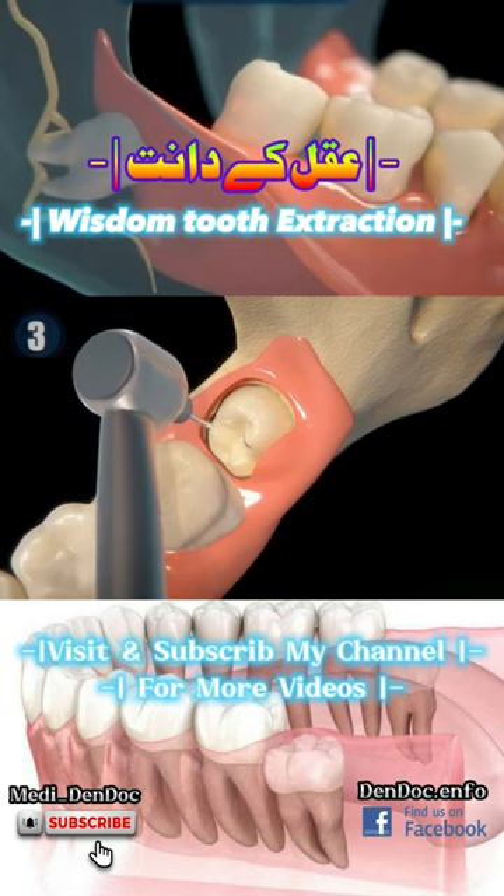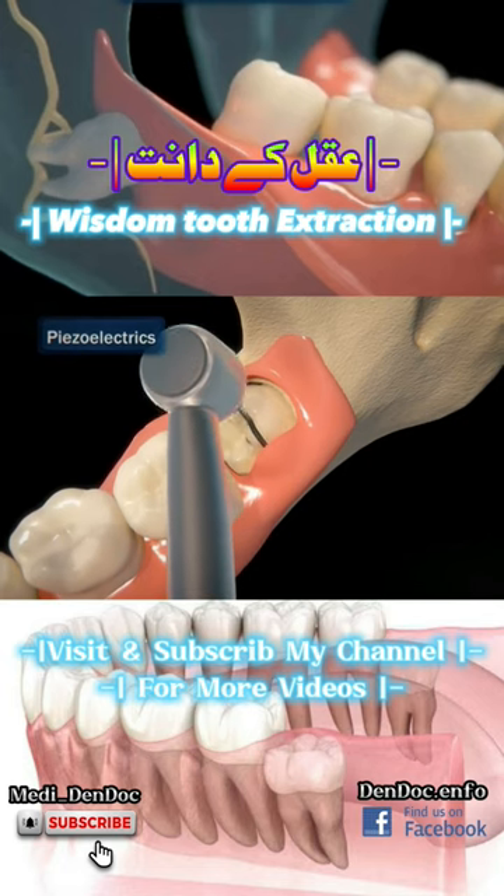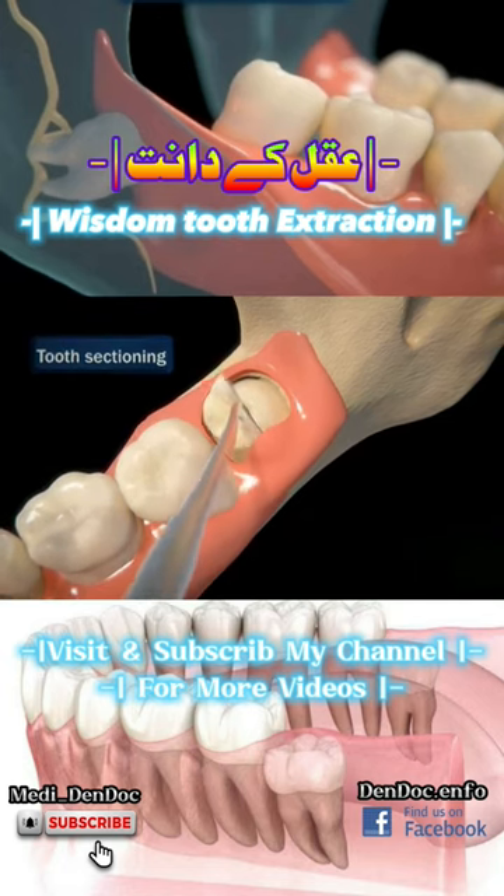Later, contouring will be carried out at the level of the tooth and bone, and then a cut in the wisdom tooth with devices called piezoelectrics, which are used to divide the tooth into parts so that extraction is easier — a process called tooth sectioning.